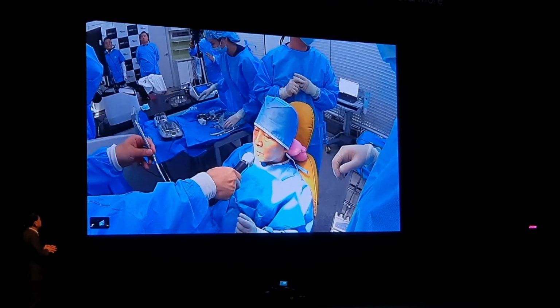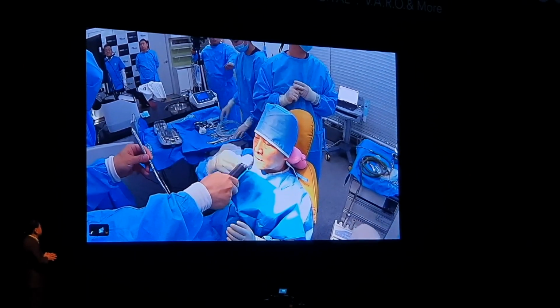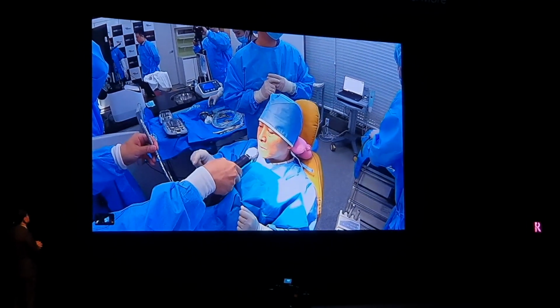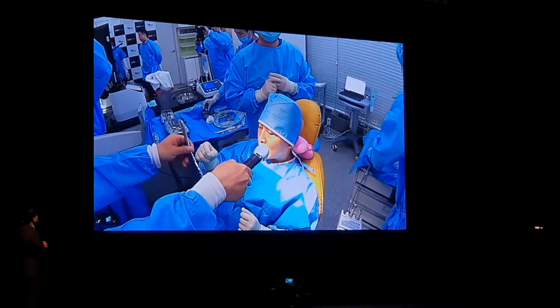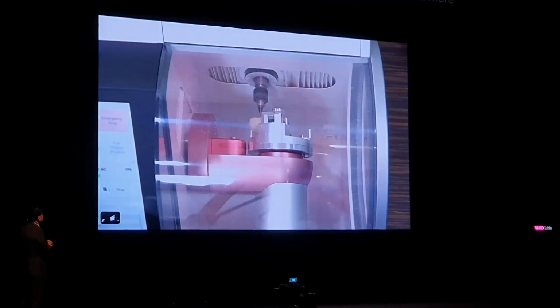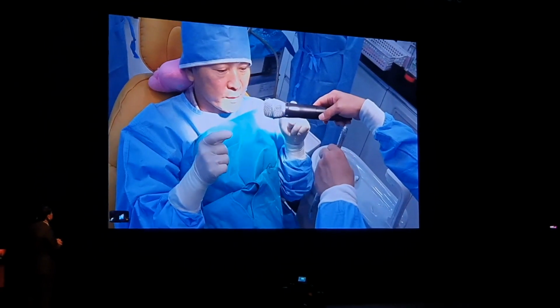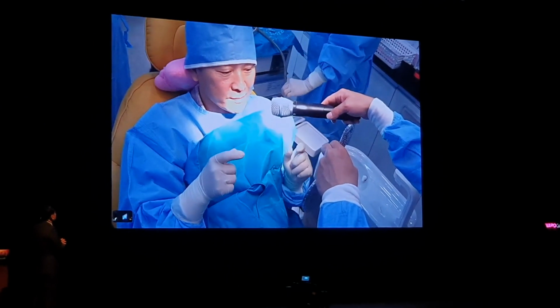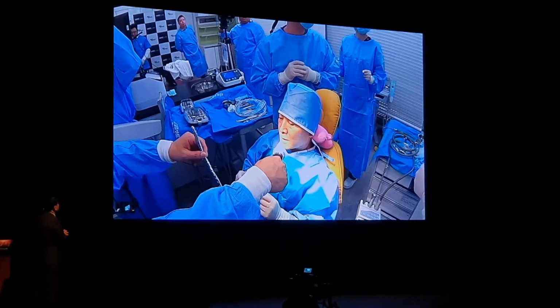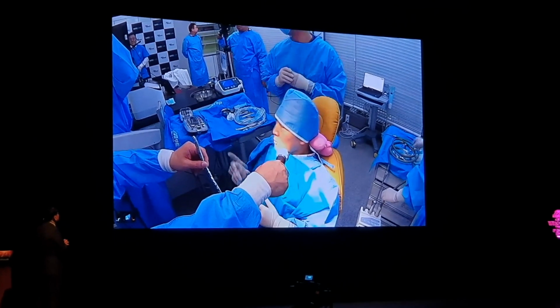Because I need to see for myself, I won't cover my face with the surgical drapes. Instead, I have my face surface disinfected, and from here I look into the mirror and perform the surgery. Locate the mirror here, more towards the back, a bit more, slightly this way. So if I do this, move over, a little to the side. Okay, can someone help him? Perhaps it's better with the bigger mirror. The mirror seems a bit too small. Well, for now we start from here.